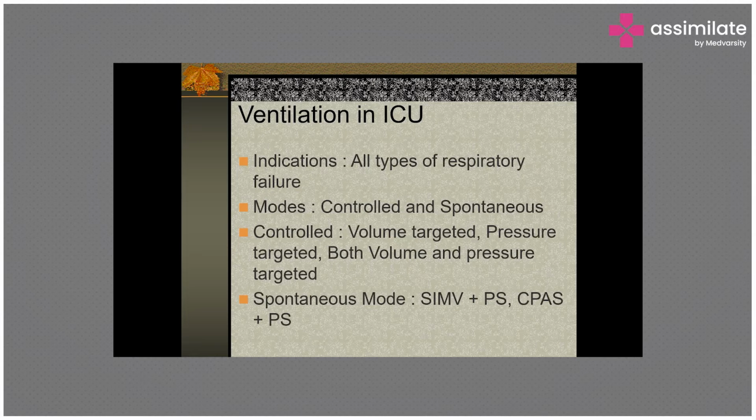or biotrauma. Biotrauma means whenever the volume is not kept constant, and there is shear and stress injury to the alveoli, there will be release of inflammatory mediators that can cause further damage to the adjacent alveoli, and the lungs may get injured again because of this biotrauma. So that's why it is very important that when we ventilate the patient, the volume has to be as low as possible, which is acceptable to maintain oxygenation and to keep the carbon dioxide in check. So the volume targeted ventilation is quite useful in patients with ARDS.